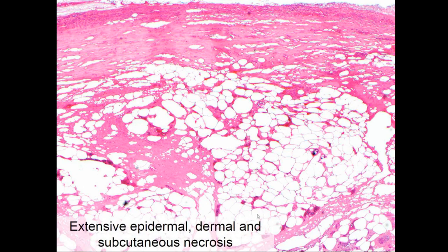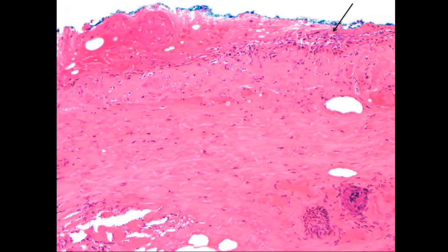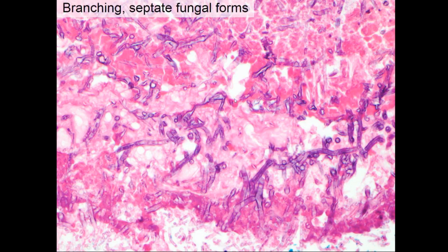The skin biopsy showed extensive epidermal, dermal, and subcutaneous necrosis. I draw your attention to the area shown here. At high power, we saw branching septate fungal forms.